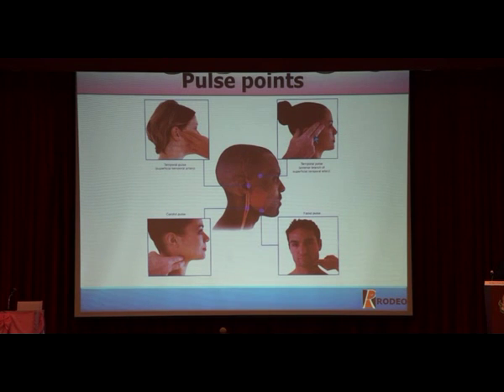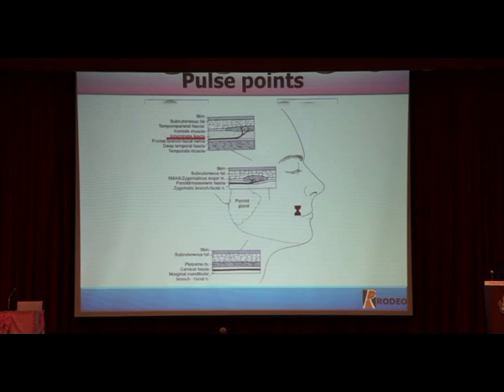The first point to check in the patient is the severe complication of barbed thread, hematoma. Severe hematoma is the first point to check. Check the temporal area, temporal pulsation, carotid, and facial pulse. Be careful in this area. And about anatomy at the thread insertion area: first the temporal area, the innominate fascia, because the innominate fascia is a very tense area.